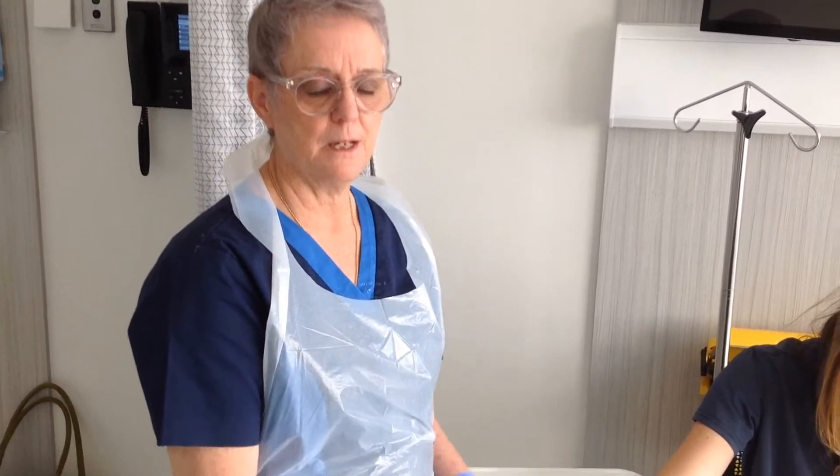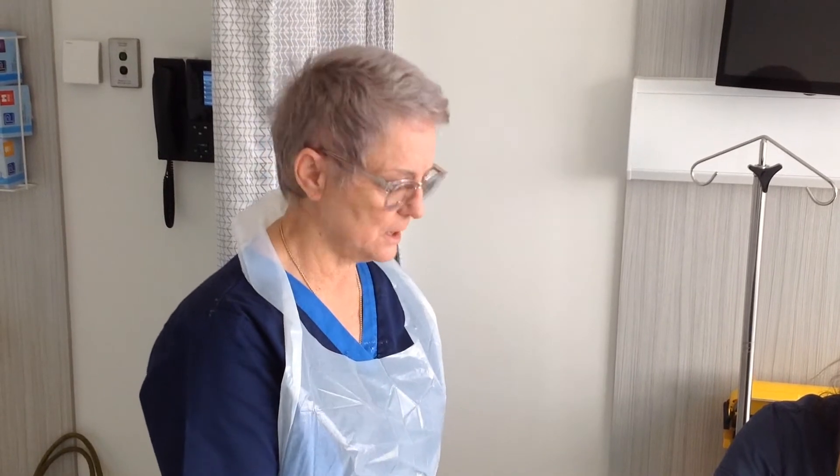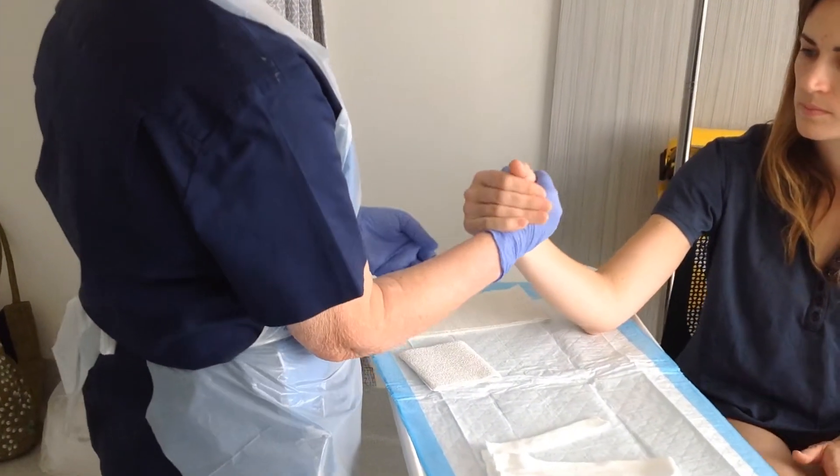Hi, I'm Jackie from the University of Adelaide, and today I'm going to demonstrate the basic guidelines for the application of a thumb spica splint. This splinting is usually used for patients who have suspected scaphoid fractures. We'll pop our patient into position, which is a bit like an Indian arm wrestle.